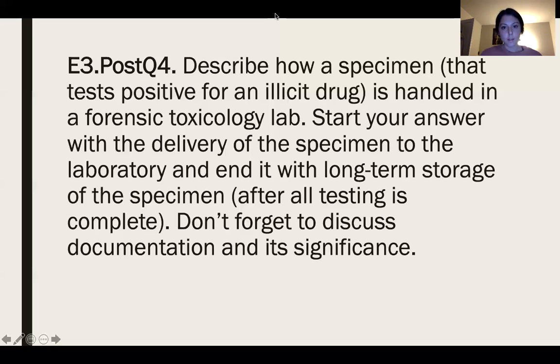When they are done, they will take that evidence back into the evidence collection room, and a lab supervisor will go over all of their testing to make sure that they did everything correctly and up to protocol. Then the technician can be notified that the testing is done, and the technician can make sure that the evidence goes into long-term storage, which would be like freezing it, just to make sure that it's preserved for the certain amount of time that the lab requires it to stay there.